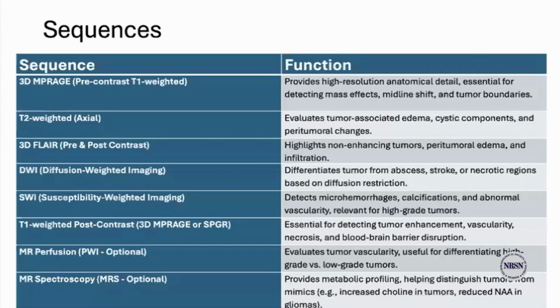Again, MRI perfusion, we still don't do that, but in some cases in other facilities, and I'm excited to hear about this from you guys, they do the MRI perfusion, or it's actually recommended to do an MRI perfusion to evaluate tumor vascularity and help in differentiating high versus low grade tumors.